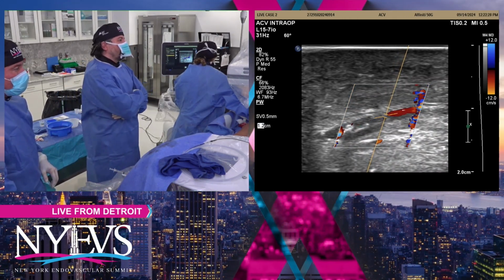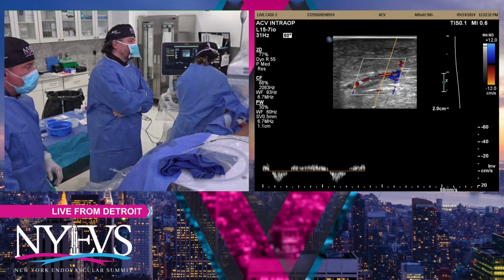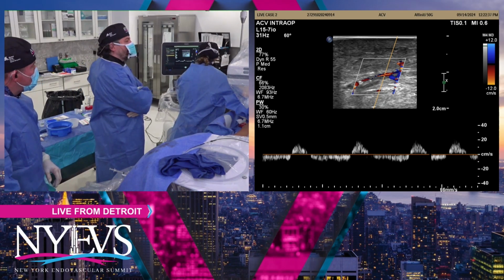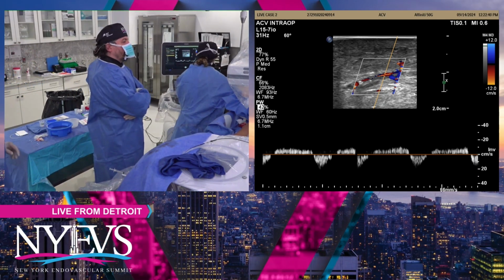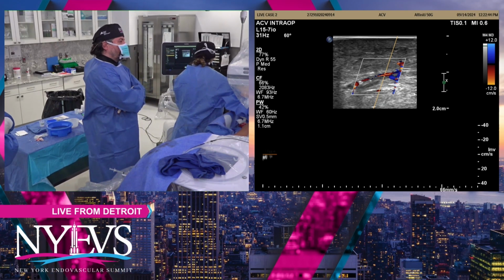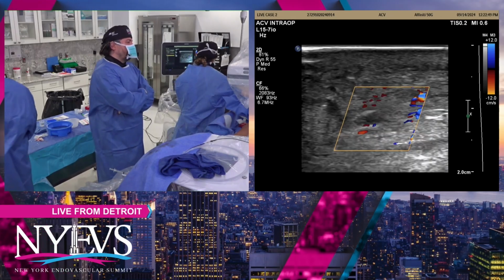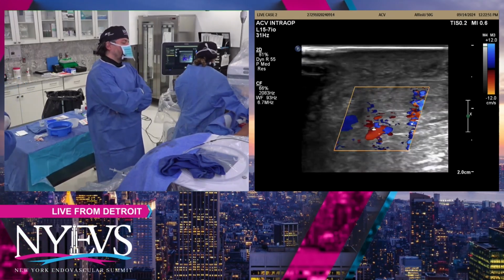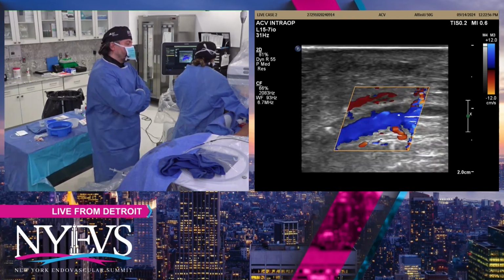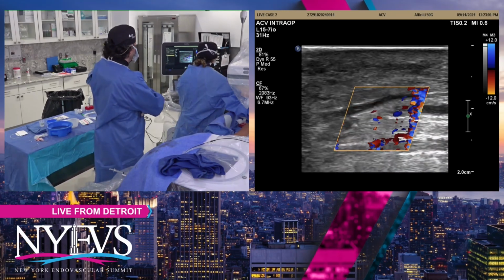So the dorsalis pedis artery here was at least 2.5 millimeter. So I usually would go down 0.5 millimeter. I will size the balloon based on the arcuate artery size. I think that if that common plantar or lateral plantar was open, it would be a 2.5 millimeter vessel. But since I'm going to balloon across the arcuate artery, I'm going to size my balloon to that, which I usually take 0.5 millimeter less than what I use for the DP or the lateral plantar.